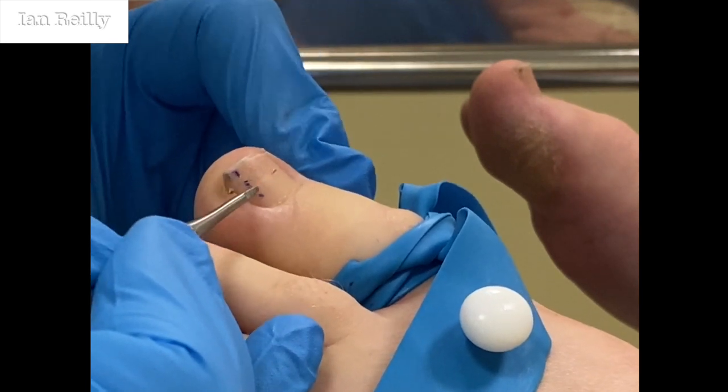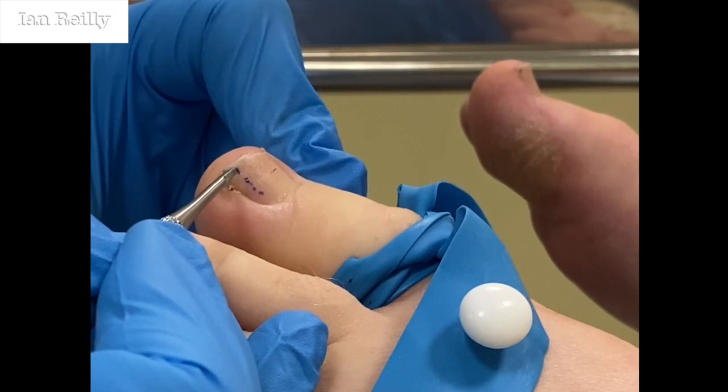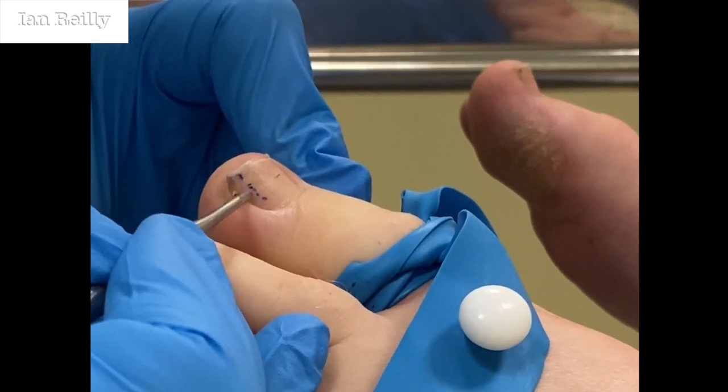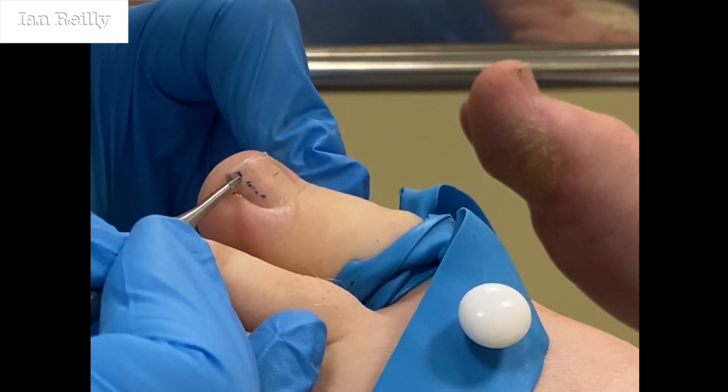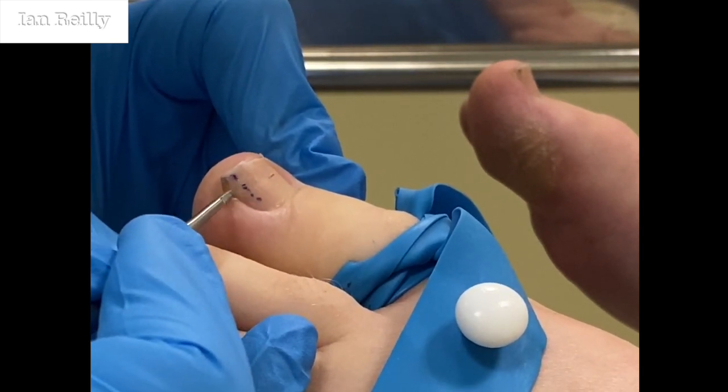So you can do a nail surgery, and this was the one that was done previously, wasn't it, by GP? How many times was it done? Just twice. Yeah. So it's been done twice by GP, and it's kind of regrown. So we've got the argument, and it's been phenolised in the past as well. It wasn't just that the GP took the nail off. So we've had regrowth again.